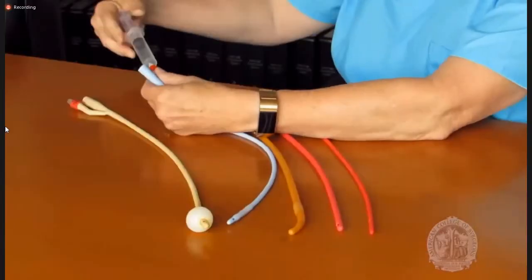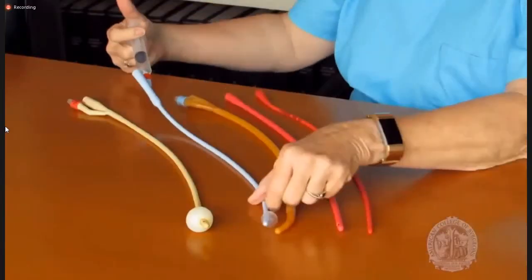while the other is used to fill the balloon with sterile water. We would put it in here like this and blow up the balloon. Be sure to check the number on the ring at the end of the catheter, because that will tell you how much volume to use when filling the balloon.